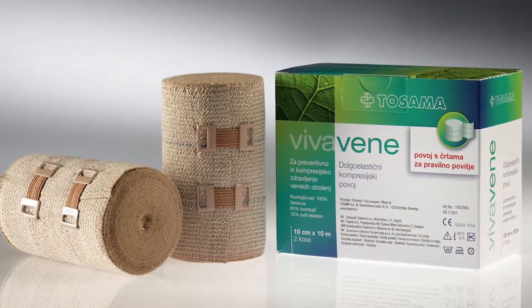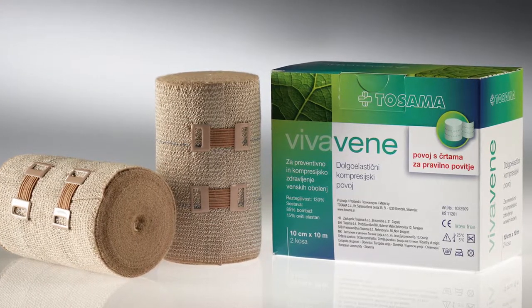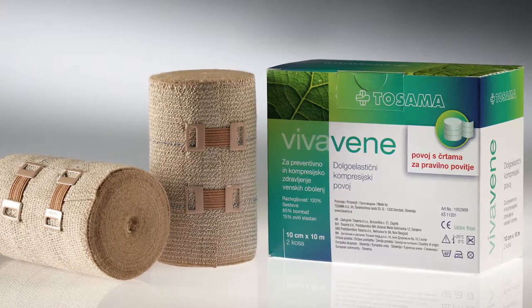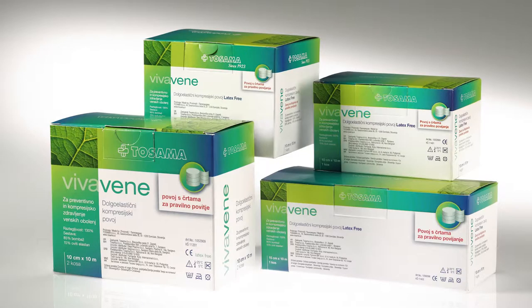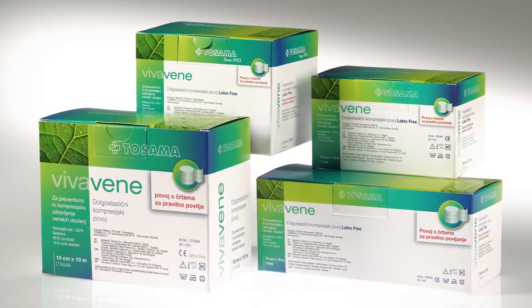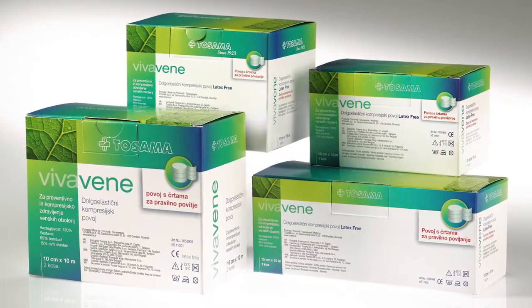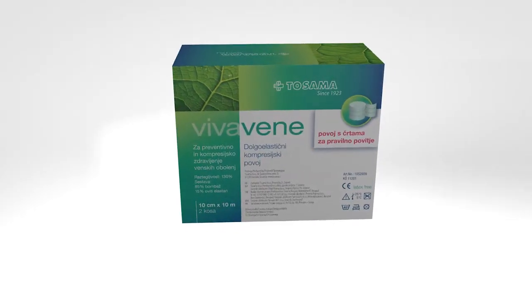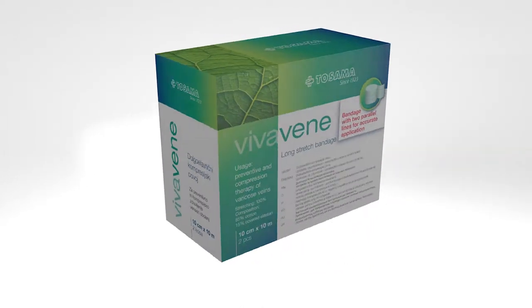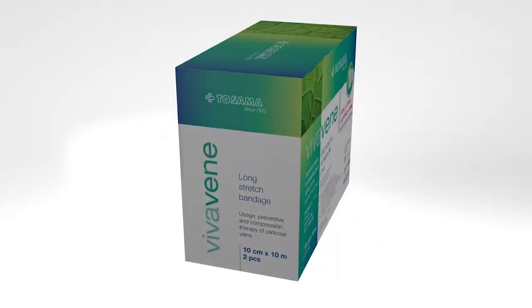Vivavene is a modern long stretch compression bandage intended for those who require daily compression therapy or regular limb wrapping, most often legs. Vivavene performs compression both during movement and during inactivity. We put the bandage on in the morning as soon as we get up, and take it off at the end of the active day. It also has to be taken off before any rest that takes more than 30 minutes.